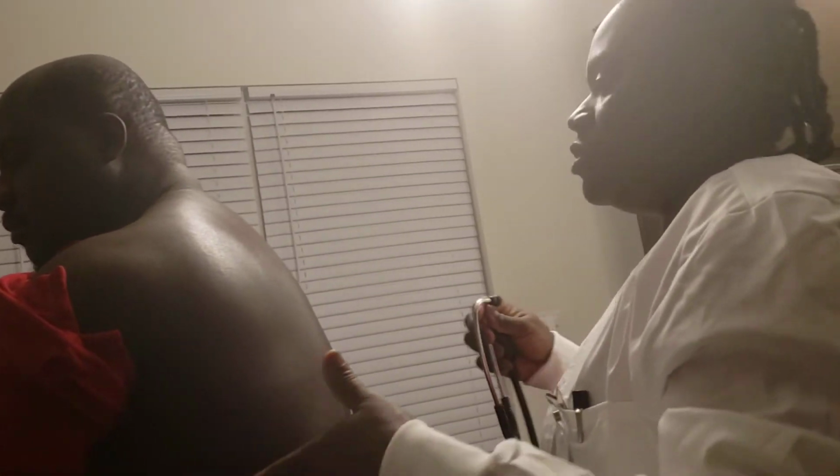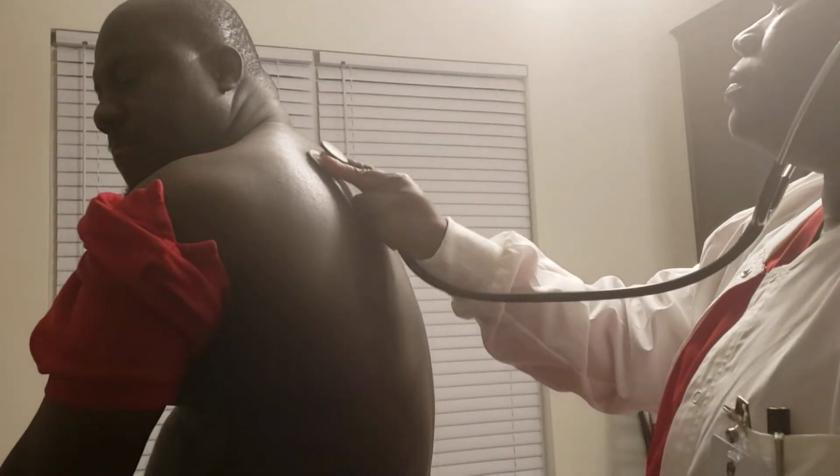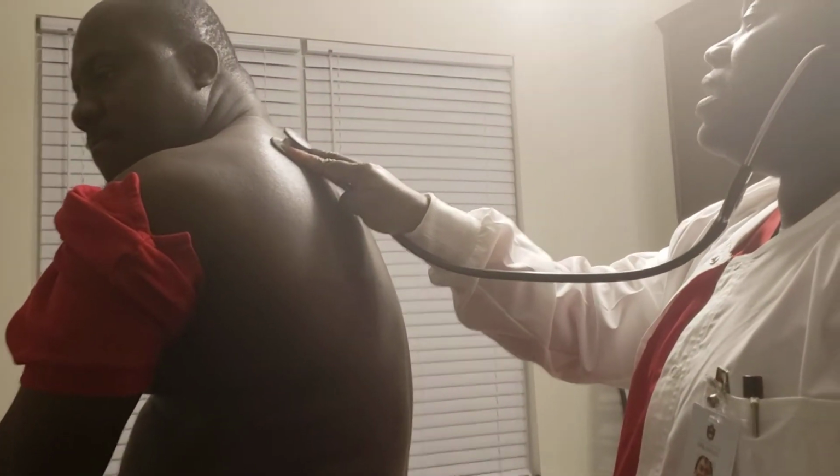That's very good. I'm going to listen to your breathing whilst you are sitting up there. I'll check the posterior and I'll come and check the anterior when you are done. I'll use the diaphragm part of my stethoscope to listen. Breathe in for me and out through your mouth. Good job.